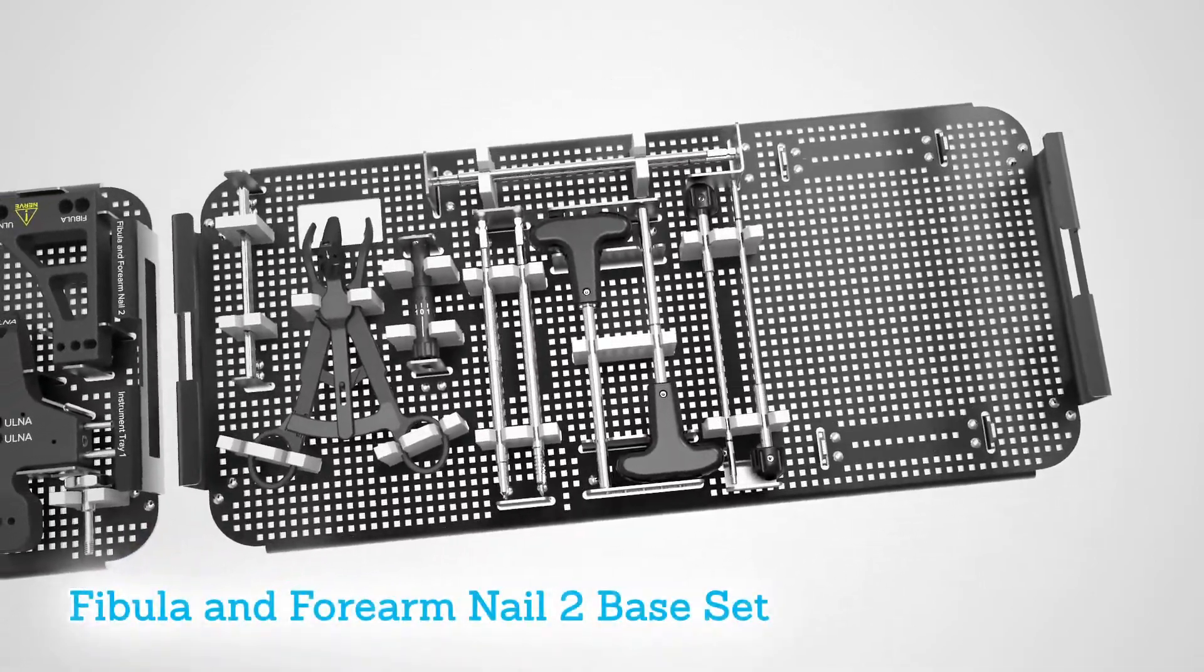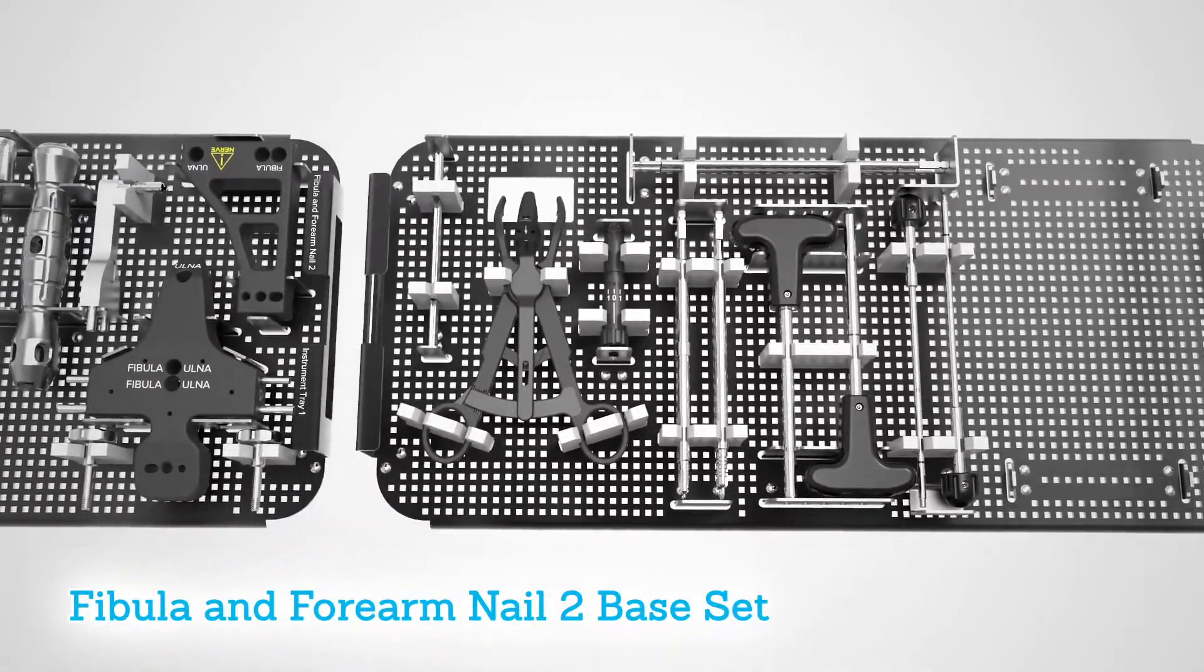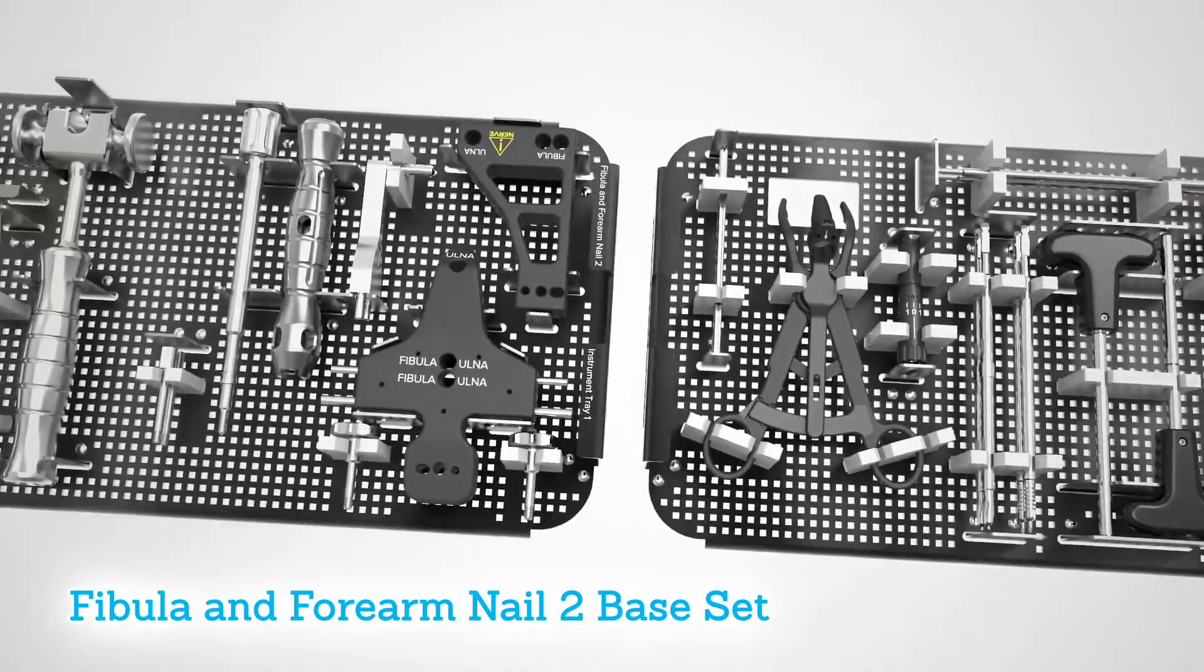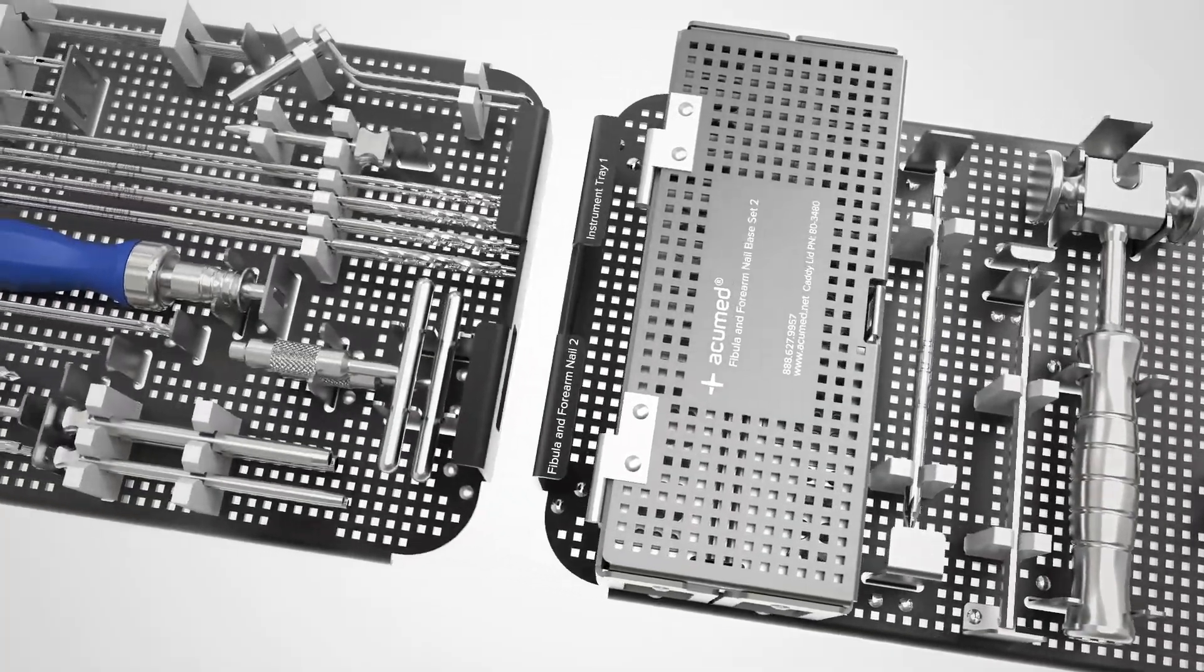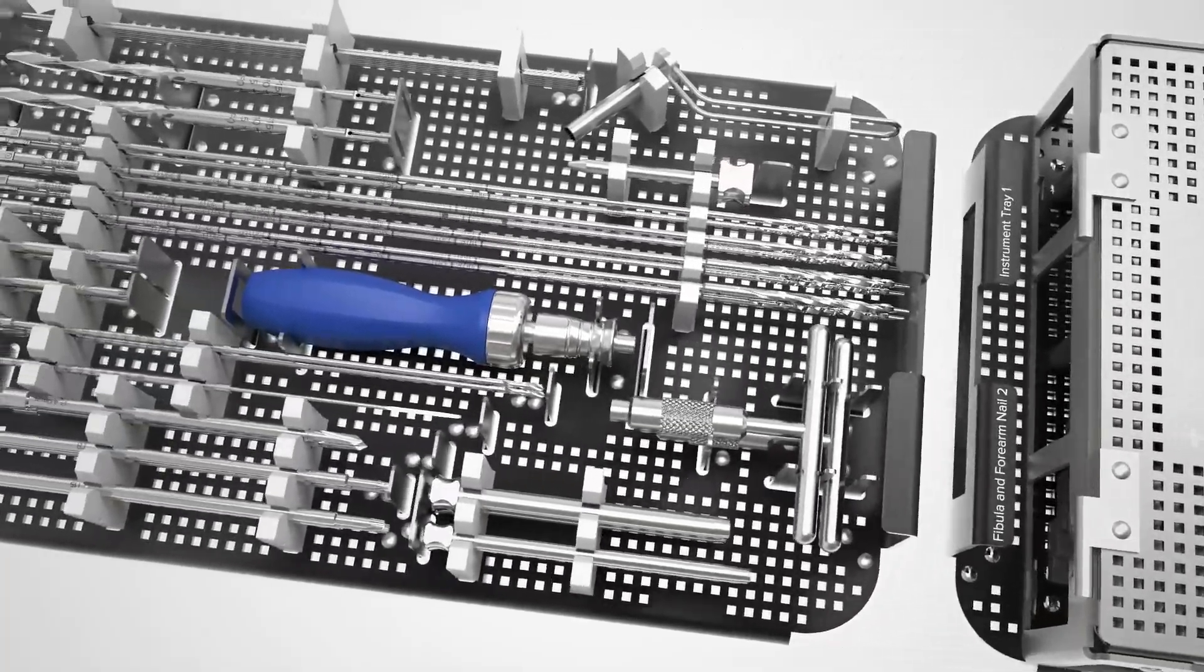The Fibula and Forearm Nail 2 Base Set is designed as a universal instrument set that supports implantation and removal of both fibula and ulna nails within the system, streamlining complementary surgical procedures.